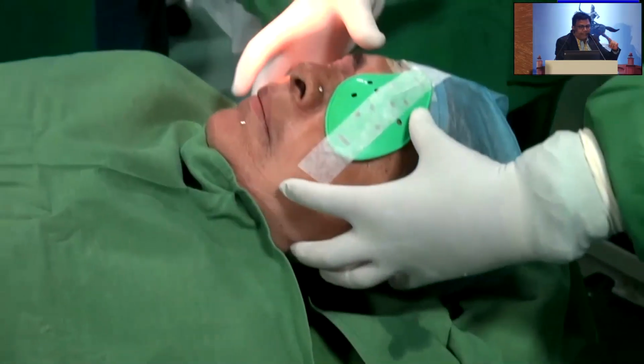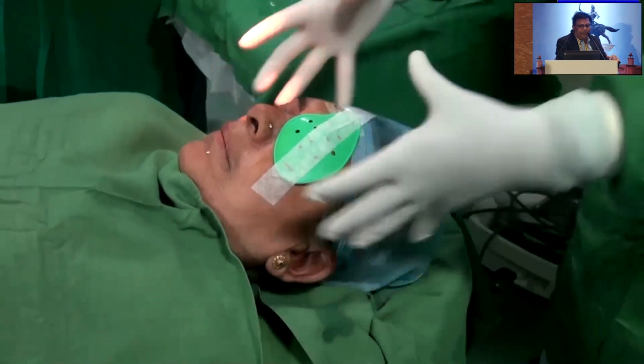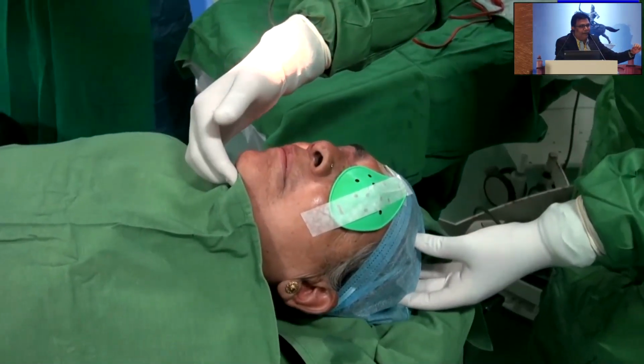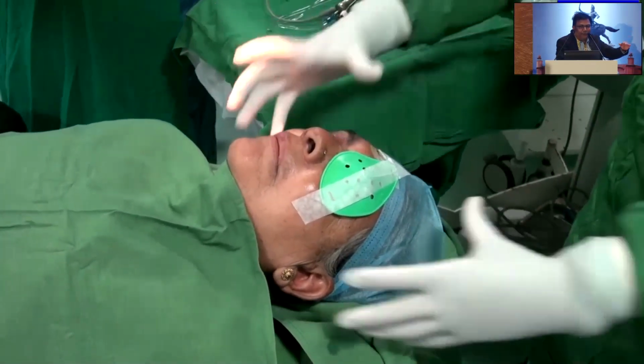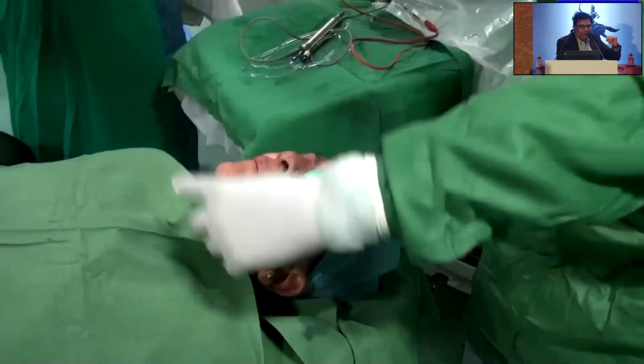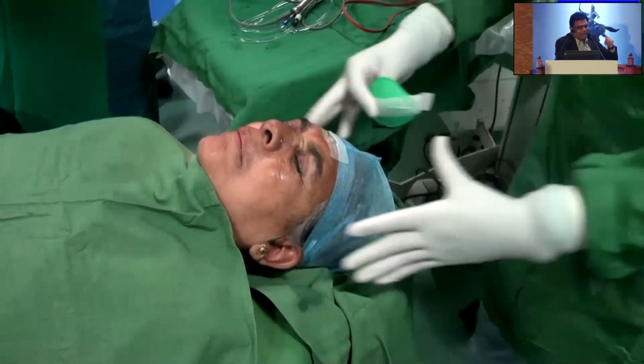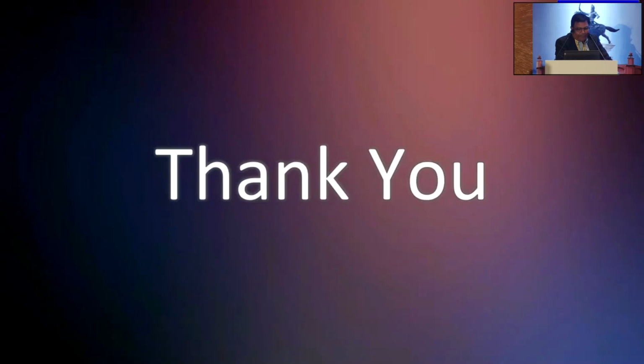And you can see the position was like this throughout the patient. So this position will be simple like this. That will also assist your phacofluidics and phacodynamics. So I always tell that if you understand simple basic points in a better way, that is advanced phaco. So this is the advancement in phacofluidics and phacodynamics. Thank you for your patience.